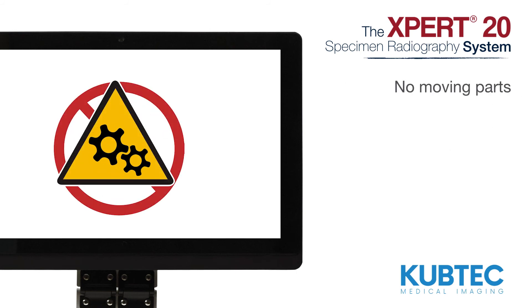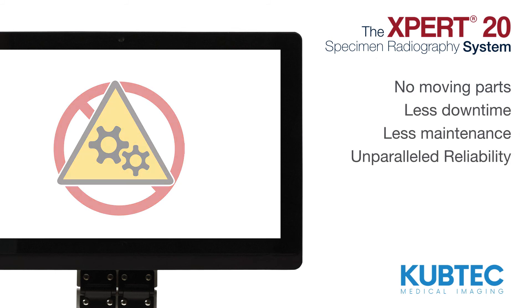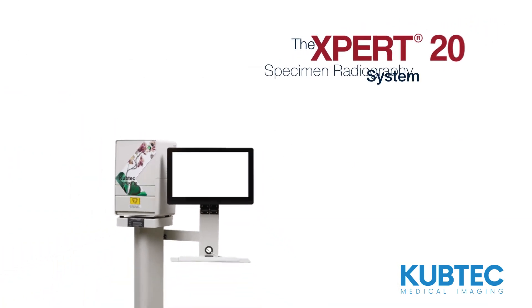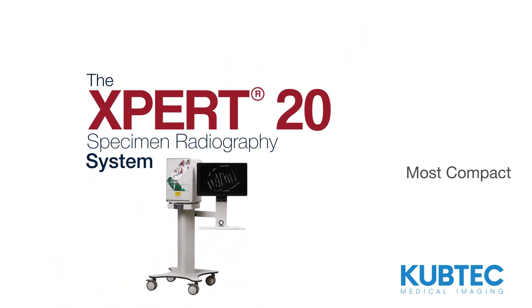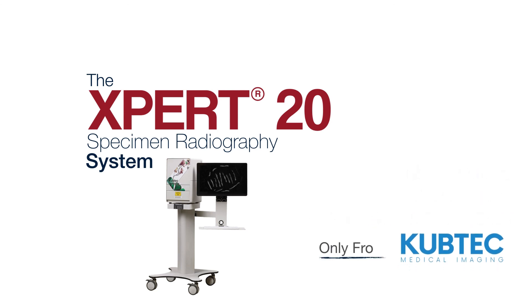With no moving parts, the Expert20 system is extremely reliable — less downtime, less maintenance, and unparalleled reliability. The Expert20 system: the most compact, most powerful solution for the biopsy suite. Only from Cubtec.